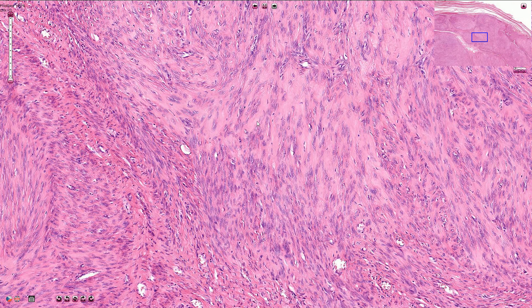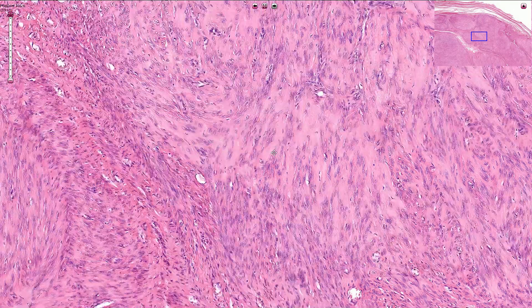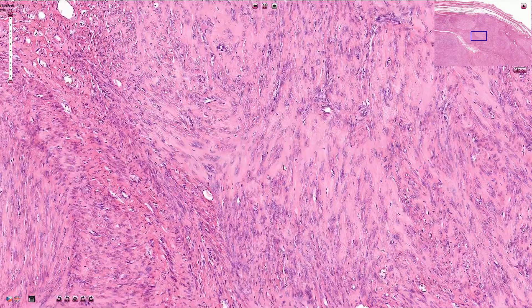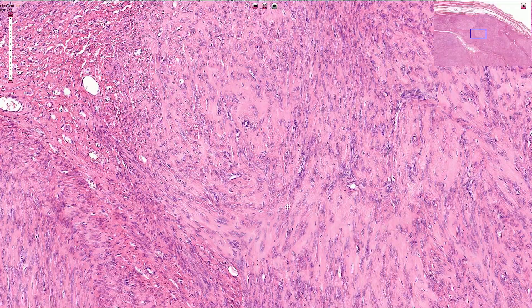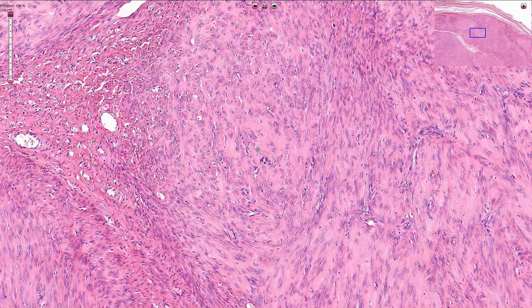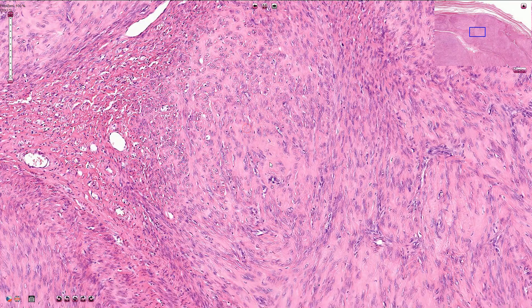However, we should always exclude leiomyosarcoma, which would be associated with necrosis, cytomorphological atypias, and atypical mitoses. Here we have a mitotic figure, for example.